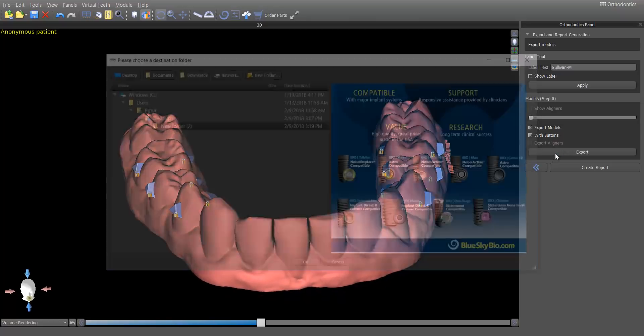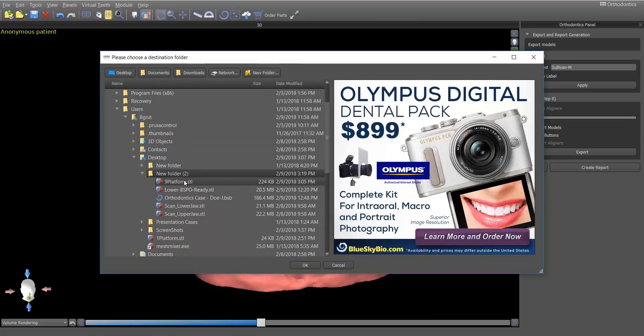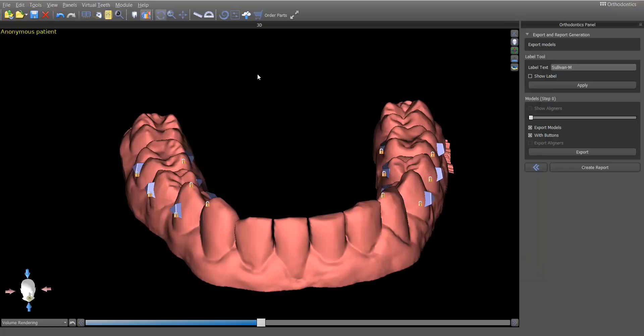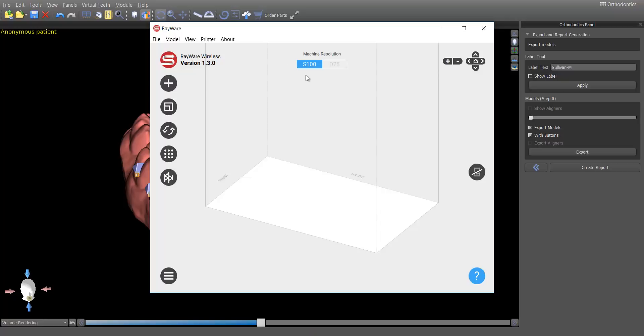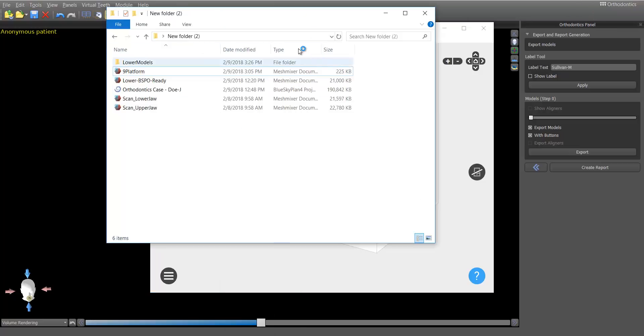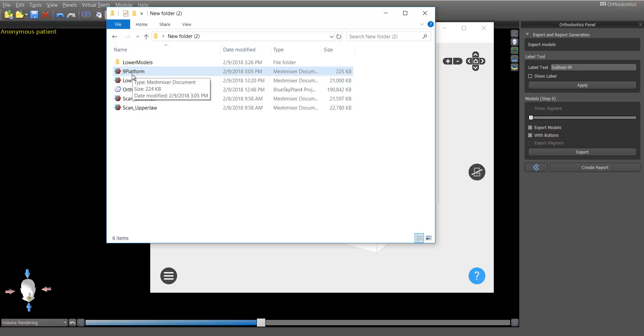So, first, I'm going to go ahead and export these. I have added the patient's name to it because it occurred to me that he actually approved using his case as an educational case. Lower models. Wait for a minute while it does the export. And then we will go ahead and open up our printing software. In this case, I'm using the Rayware software, which is with the Moonray printers.